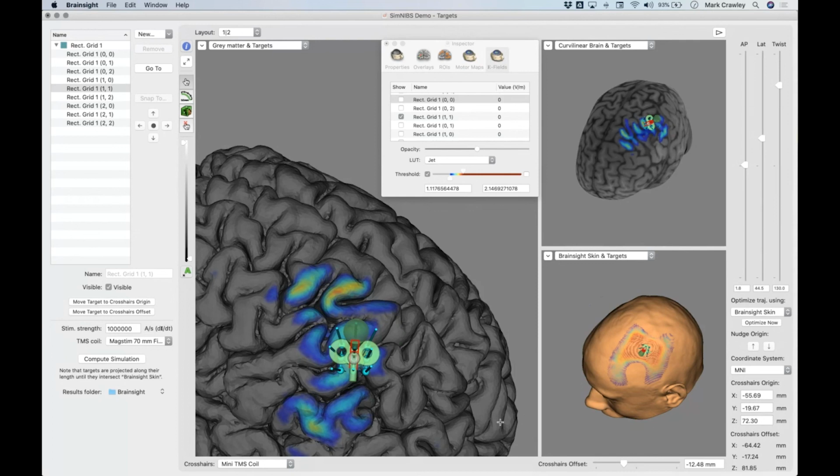So there's one now. Is it all right if I answer it, Mark? Be my guest, yeah. So somebody's asked, what MRI data do you rely on? For TMS, it's okay to use a standard T1 because the magnetic field will travel through the skull, scalp, cerebrospinal fluid relatively unhindered. And that's what Mark's using here.